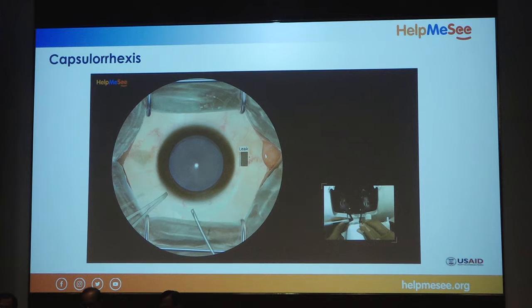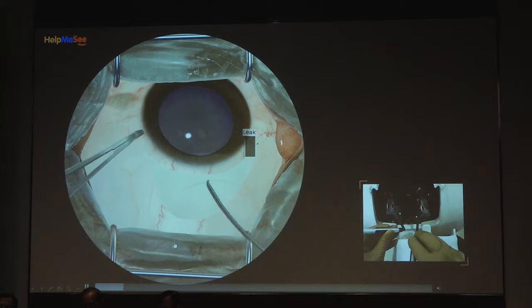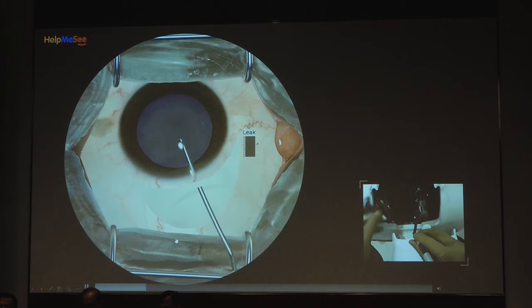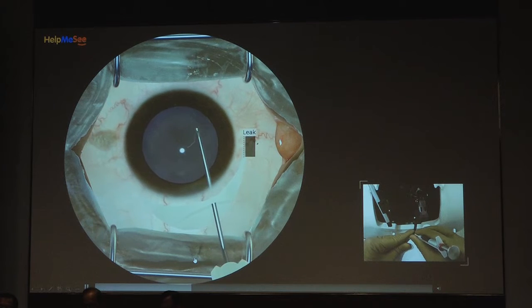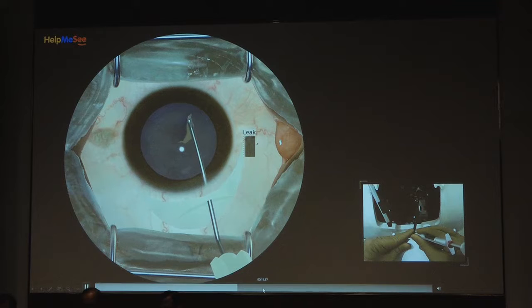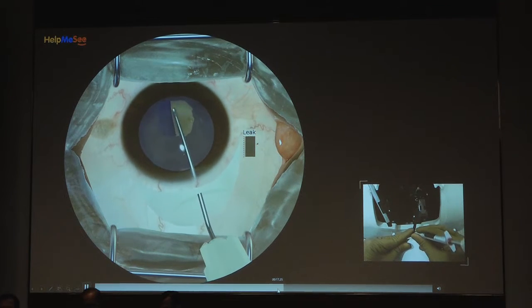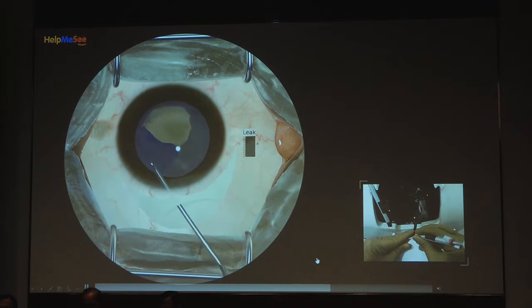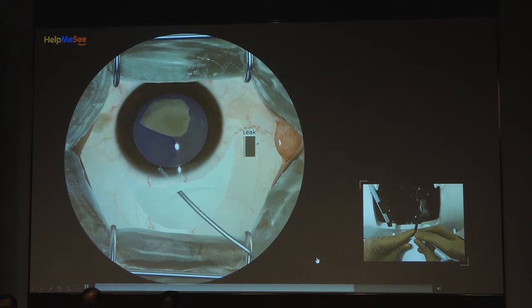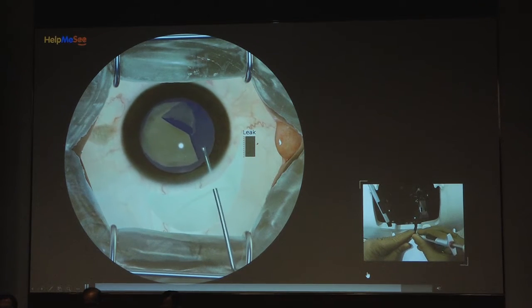Now we'll be proceeding towards the CCC, the most important part and the most difficult part for students to perform. So here we take a cut, an inverted C or J-shaped cut. We make a flap, just like how we make it in our normal routine surgery, and proceed the same way as we do it in live surgery. It's very beautiful to see because you can feel the texture of the capsule even. So the simulation is actually very, very near to normal.